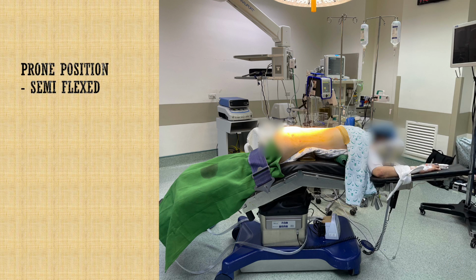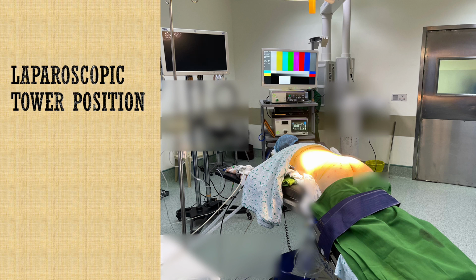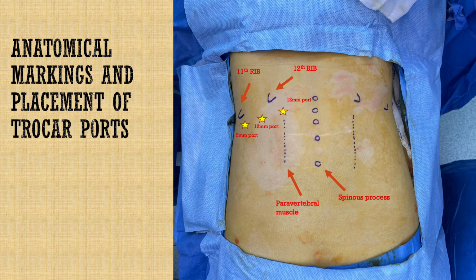The patient was placed in prone position, semi-flexed. Trocars were placed below the 12th rib, in the middle, and approximately 5 cm medially and laterally.